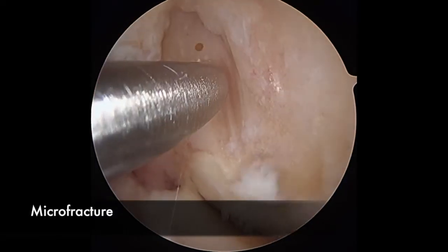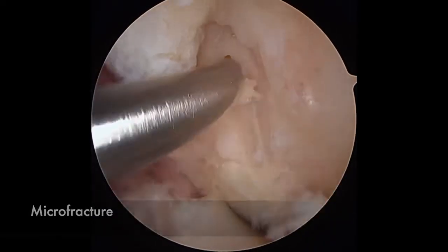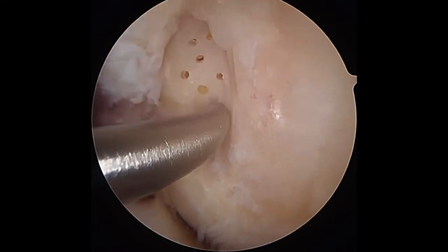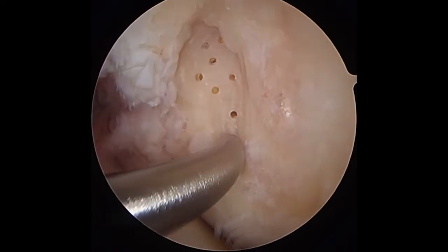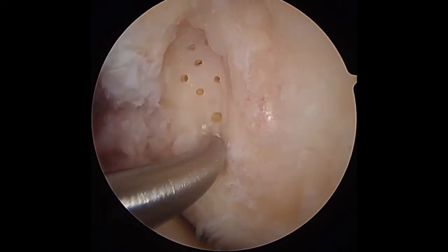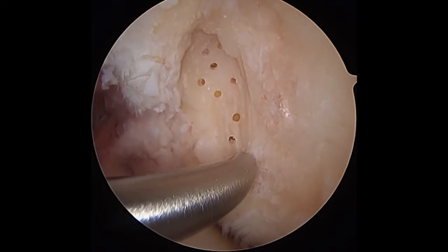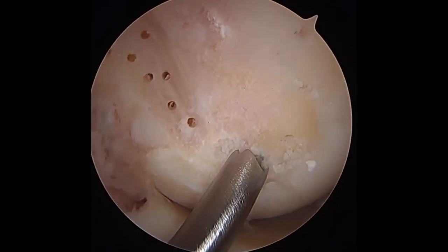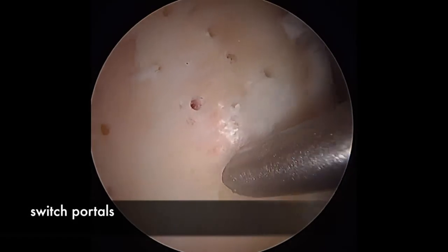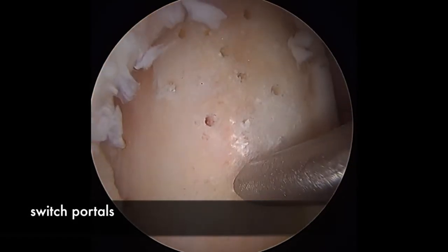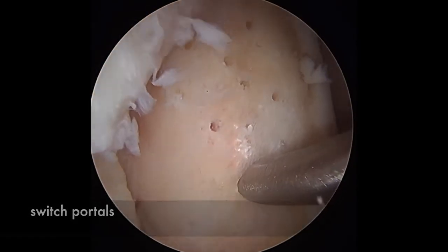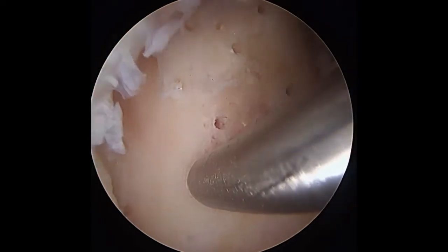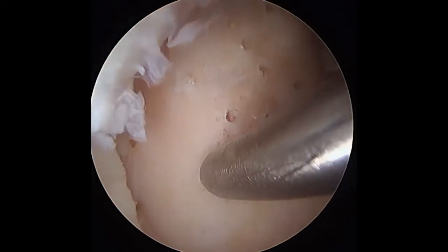Microfracture holes are drilled into the bone 2 to 3 millimeters apart using a pivot phoenix microfracture drill, starting from the lateral portal. The yellow colored marrow can be seen coming out with each new hole drilled. The phoenix drill is then switched to the medial portal to gain better angles for completing the microfracture holes in the remaining defect.